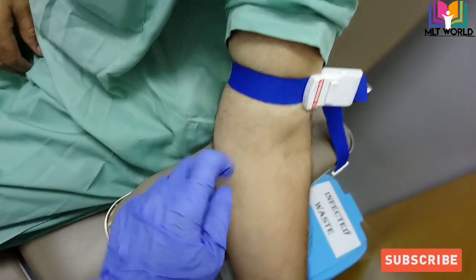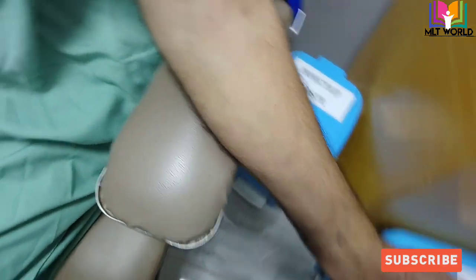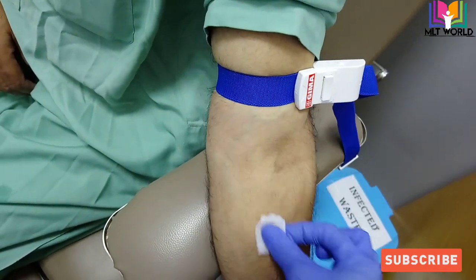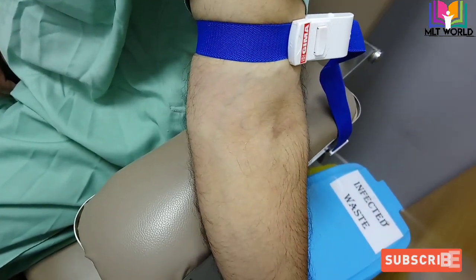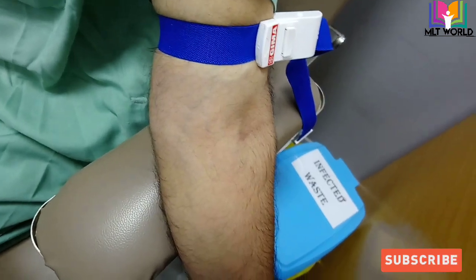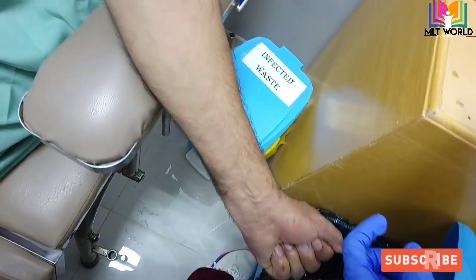Now put the tourniquet and tell the patient to keep their arm straight and fist slightly closed, then locate the vein. Once you locate the vein, clean it with an alcohol swab in a clockwise motion, then let it dry for a few seconds. After that, keep the vacutainer needle and your sample tubes ready.